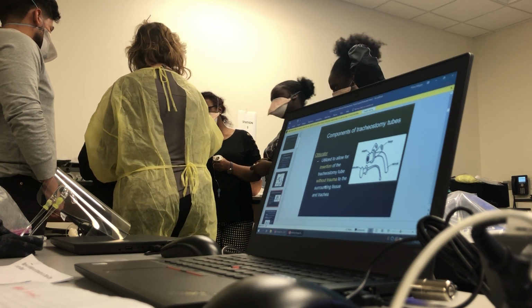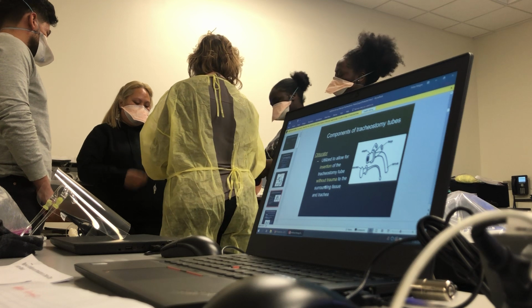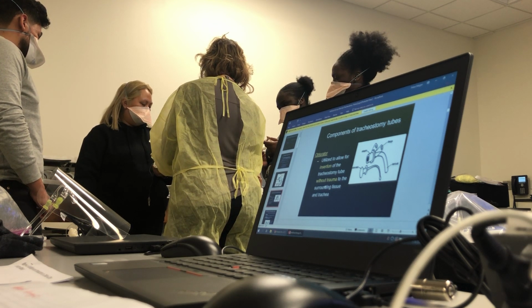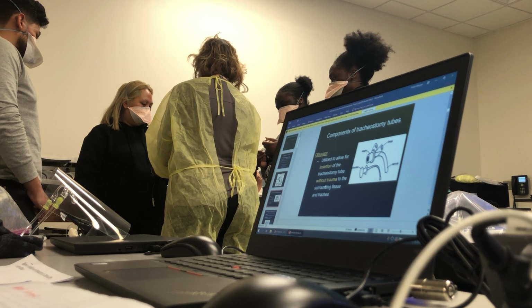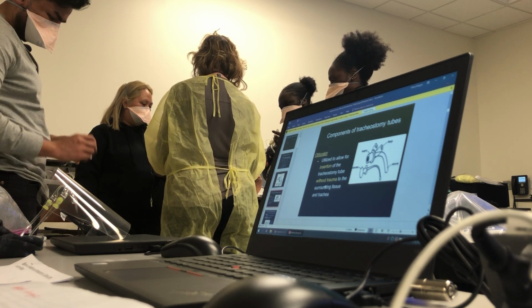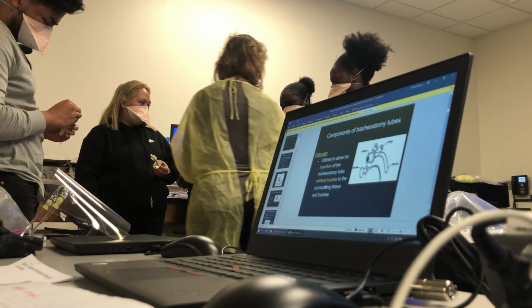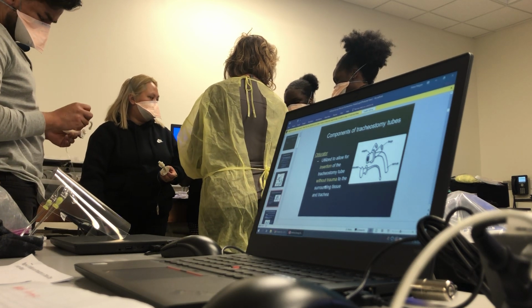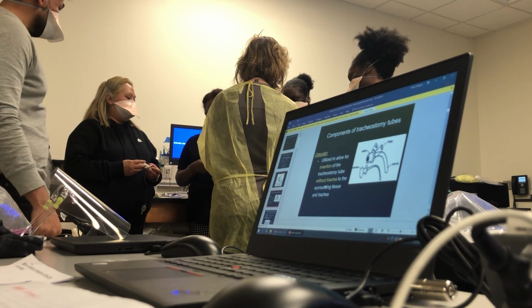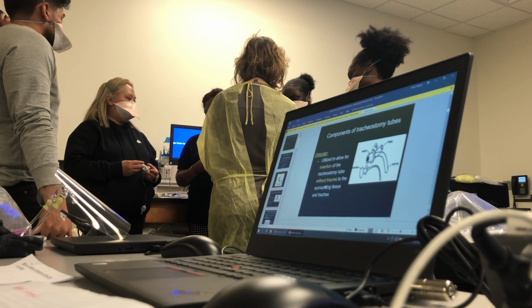See? Okay, as compared to this. I can tell, let me see. That actually doesn't feel that tight. It's not that tight. Okay. You've got your hand squeezed around there, but what I wanted you to do was fill the balloon. You filled it. Okay, put your hand around there. Okay, not tight, but as if you were the trachea surrounding the cuff.